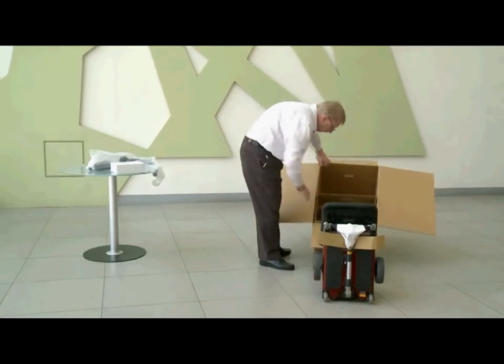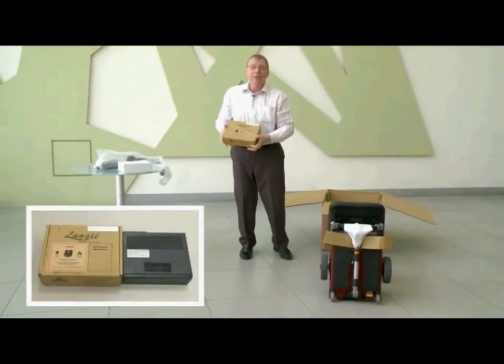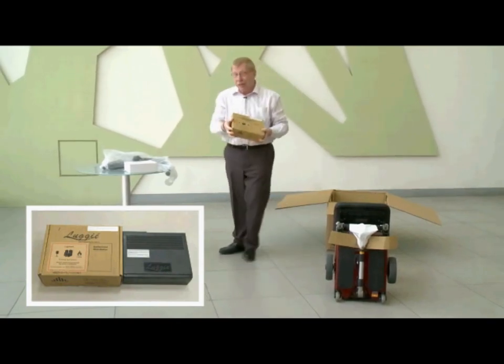Now before you forget, you need to remove this — this is your battery pack. Without this you're not going anywhere.